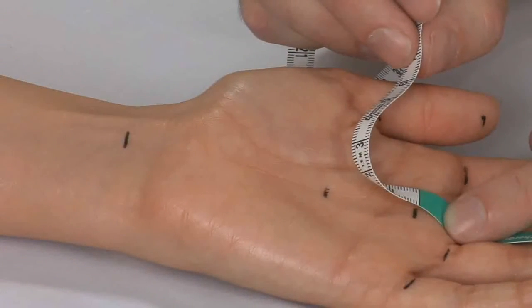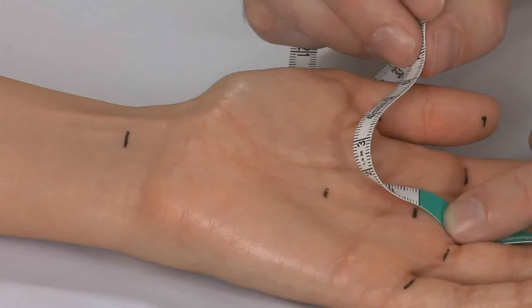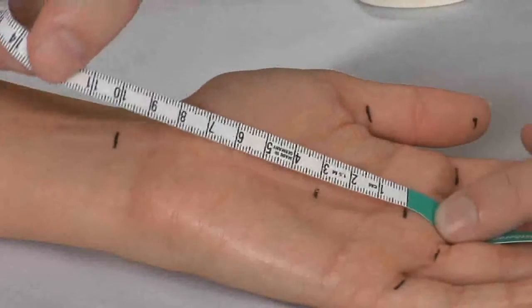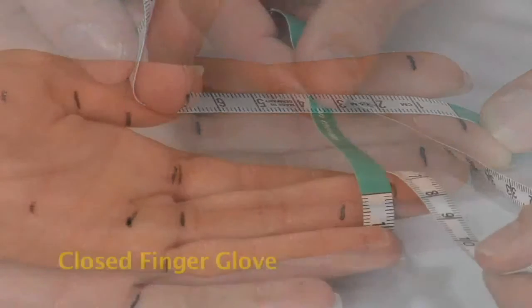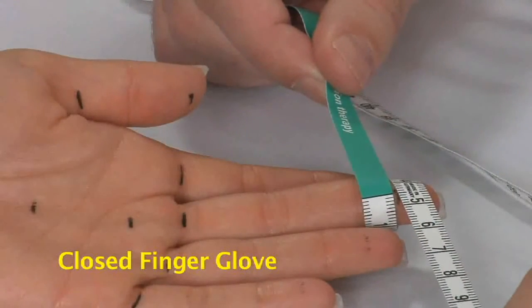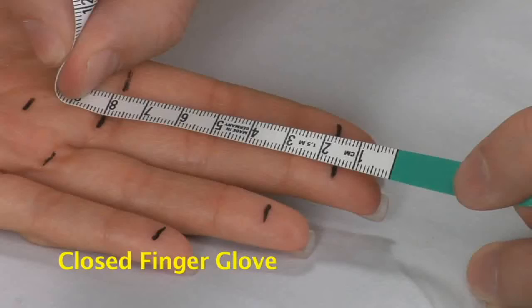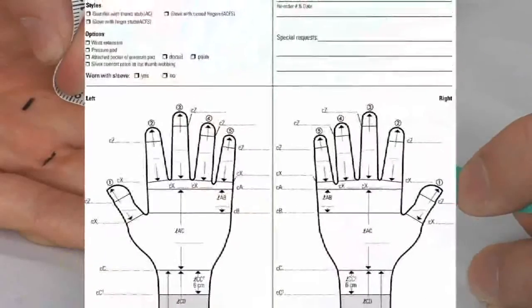Now, take the length measurement using the circumference points we just marked. First, points A to B. Then, points A to C. And last, X to Z. For a closed finger glove, take the additional circumference measurement at the base of the fingernail, point Z. Measure from point X to the end of fingertip on each finger for the length.